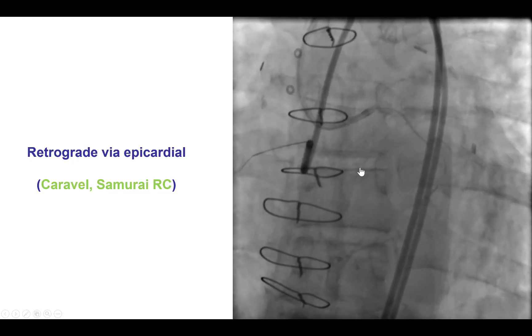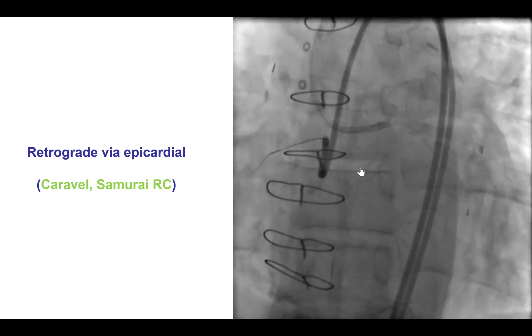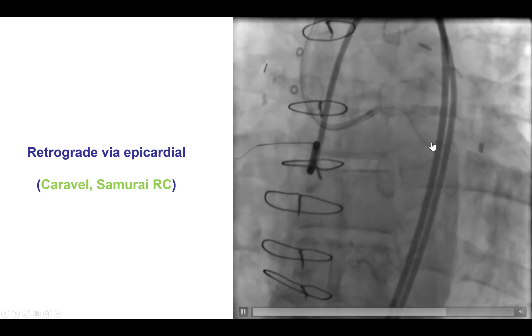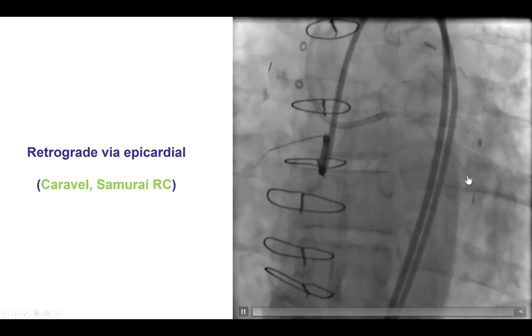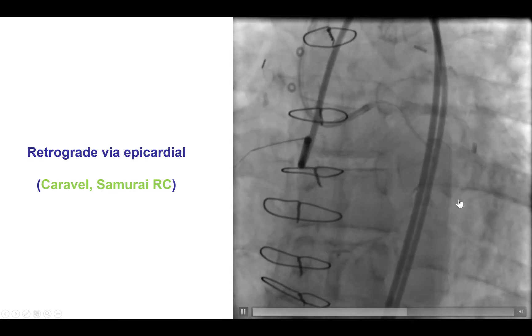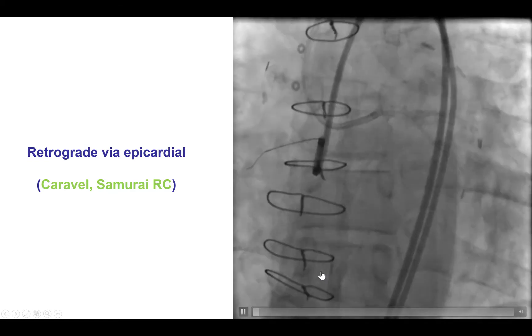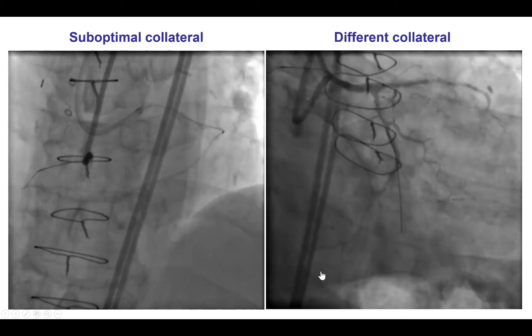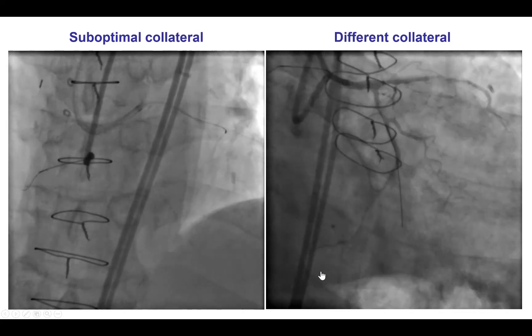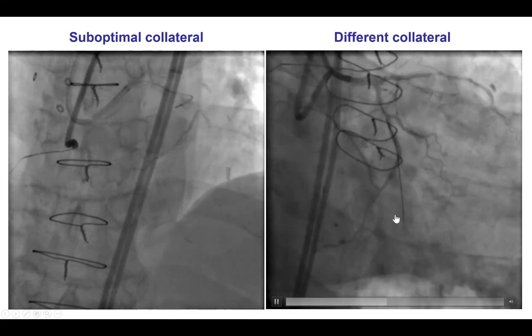That, unfortunately, failed. And that is why we then considered performing retrograde through the epicardial coming from the circumflex. We advanced a Caravel microcatheter proximally into the vessel and performed a selective injection that demonstrated a continuous connection to the distal vessel. However, that was not the optimal collateral for crossing, and so we chose a separate one that had a better connection.